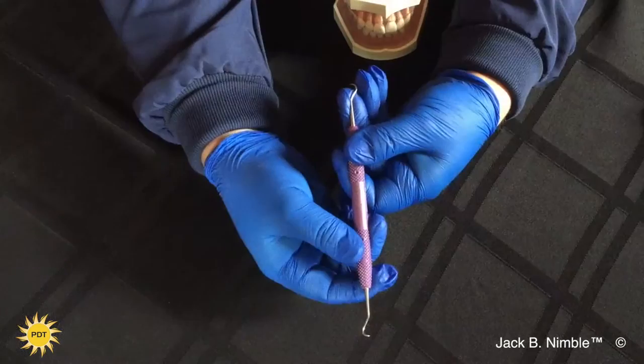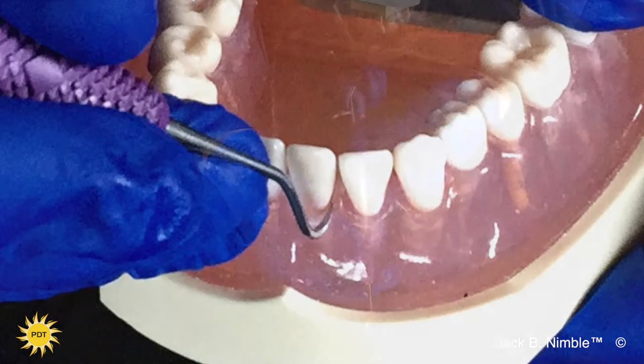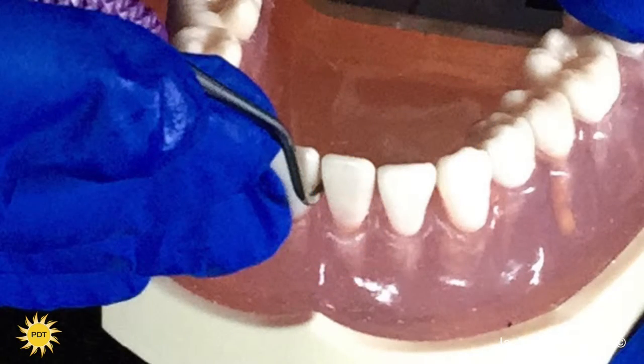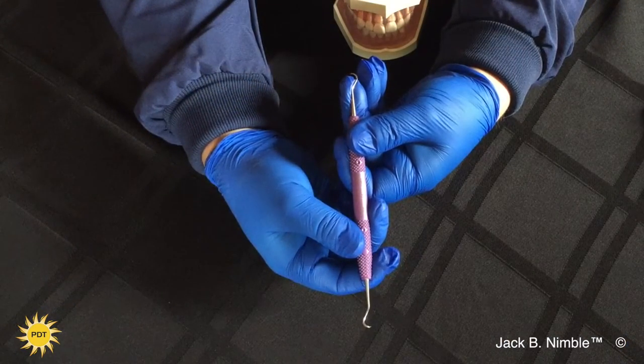This allows you to have more positive lateral pressure and the smaller curvature allows you to have better angulation and access around crowded teeth, orthodontic brackets, and it's also better for primary dentition.